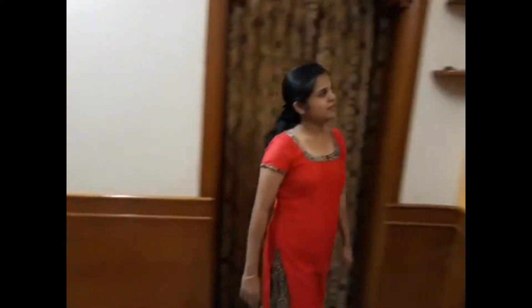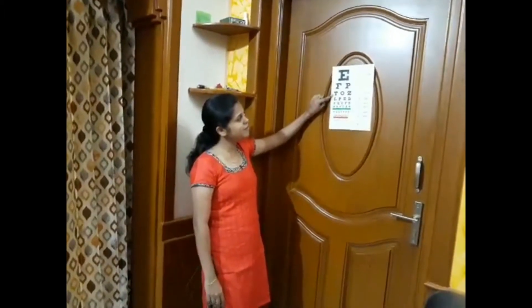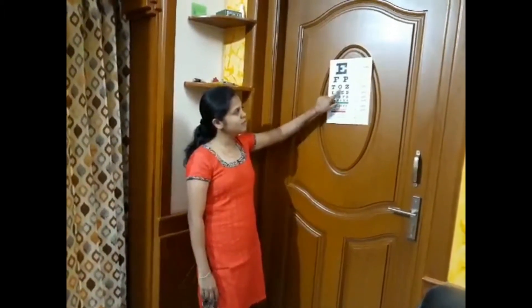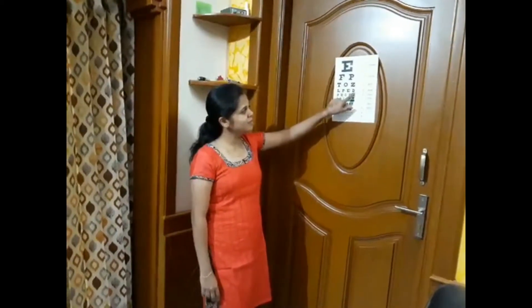First, let us go with Snellen's chart for visual acuity. Close your left eye and you read this. E, F, P, T, O, Z, L, P, E, D.